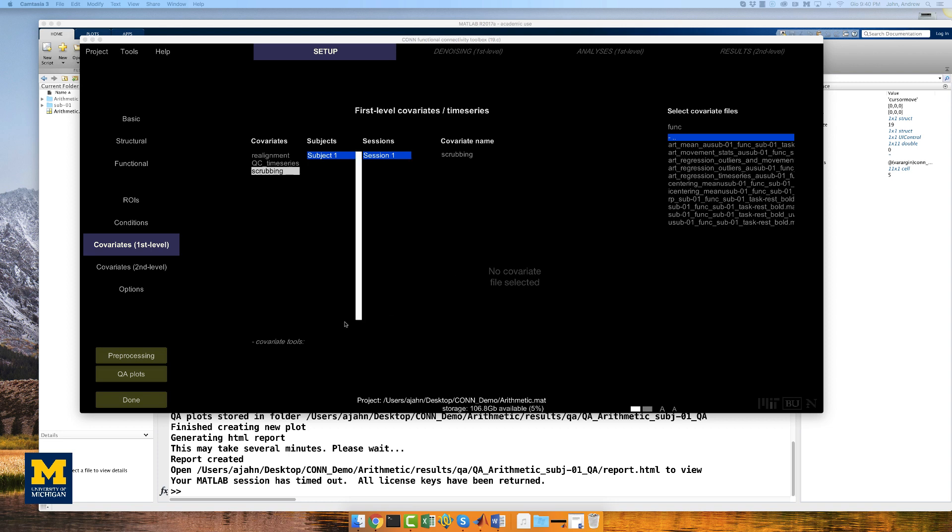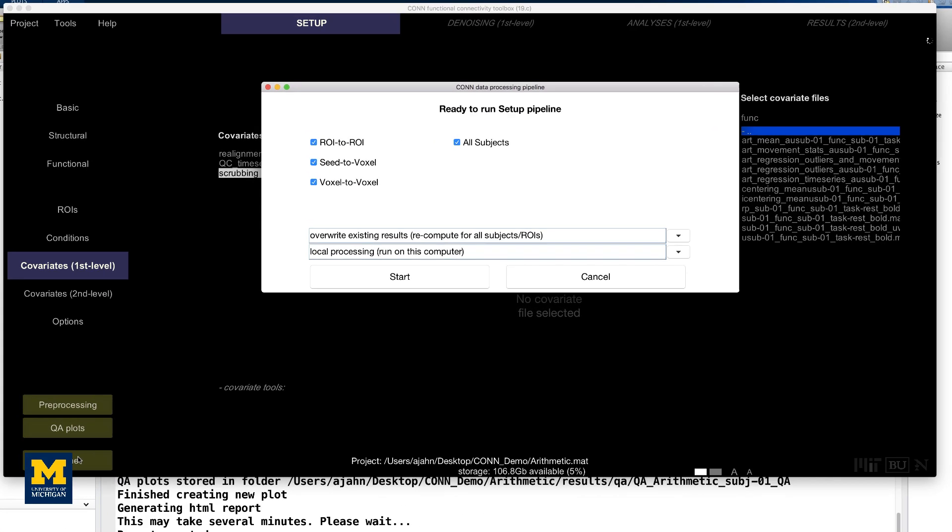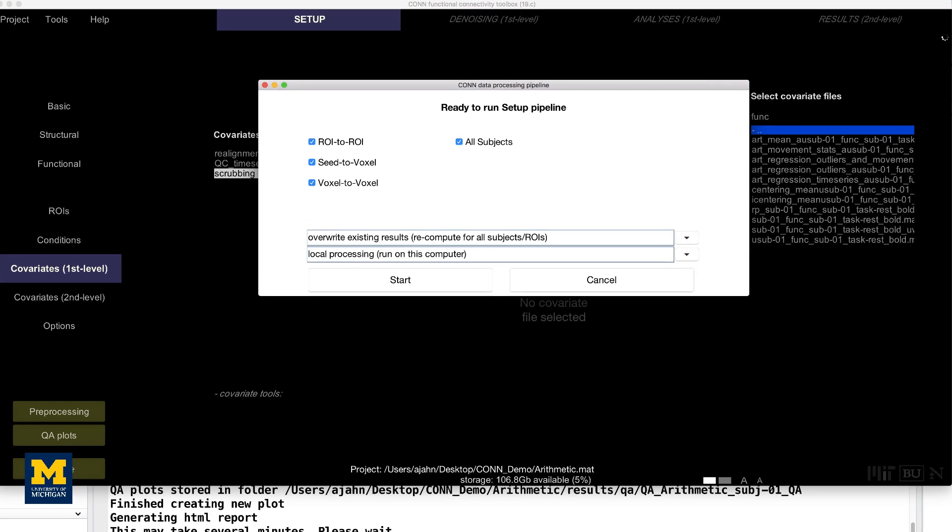To begin denoising the data, click the done button from the setup tab. A new menu will appear prompting you to select which resting state analyses you want to do: any combination of ROI to ROI, seed to voxel, and voxel to voxel. Don't worry now about what these mean, we'll cover them in a later video. All three are selected by default and we'll leave them as they are for now. Click start to begin the denoising step.